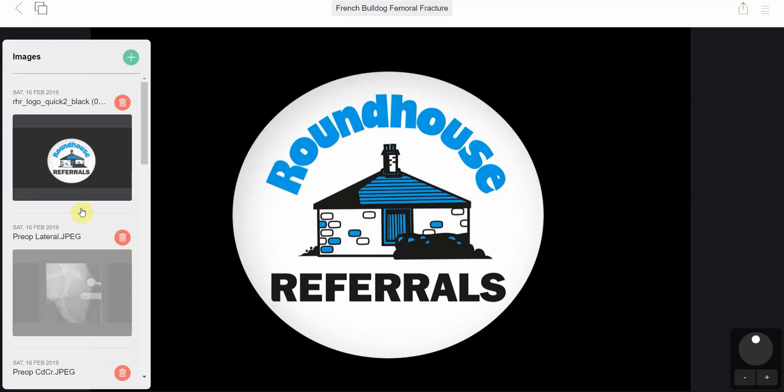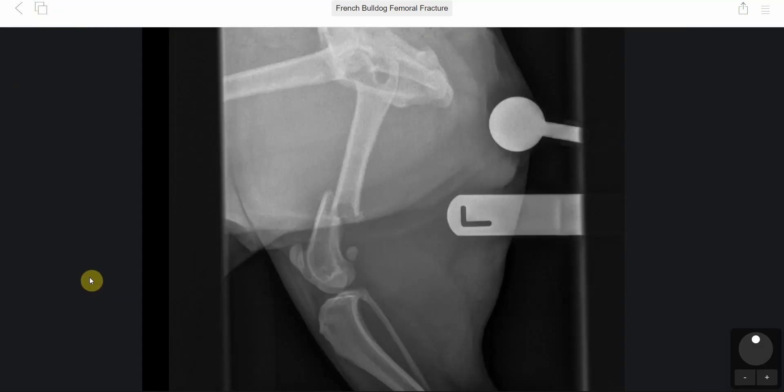The fracture we're going to look at is a fracture of a femur in a French bulldog. You can see here it's quite a simple fracture, but there is a little fragment at the back, so it wasn't totally reducible.